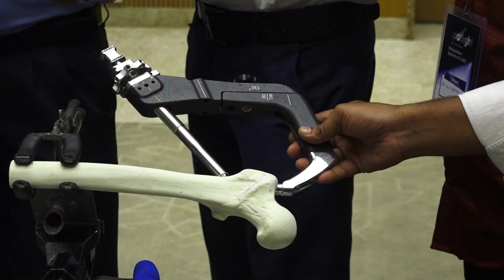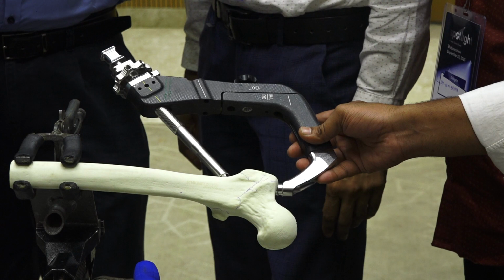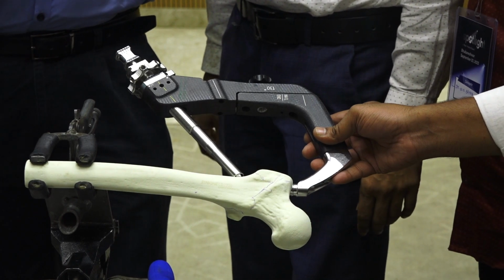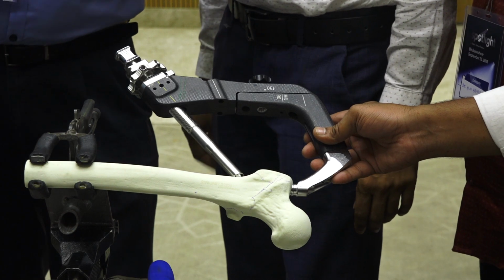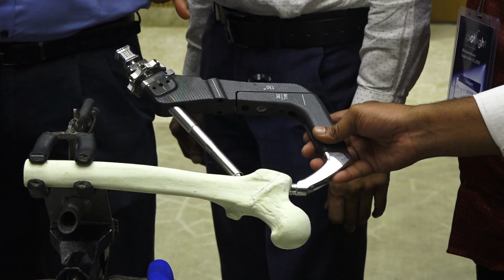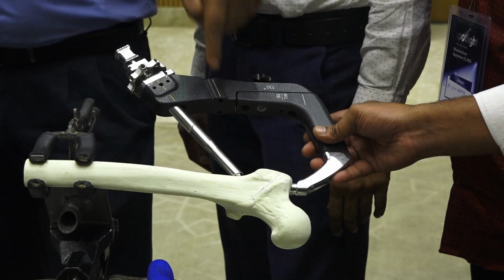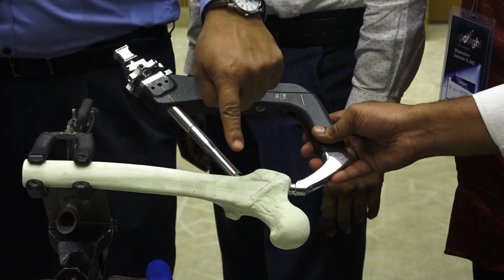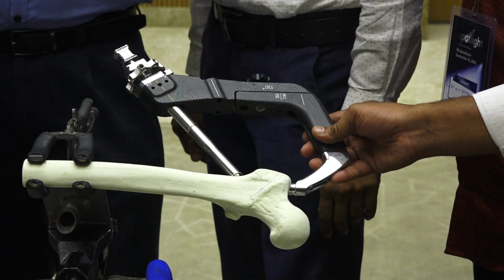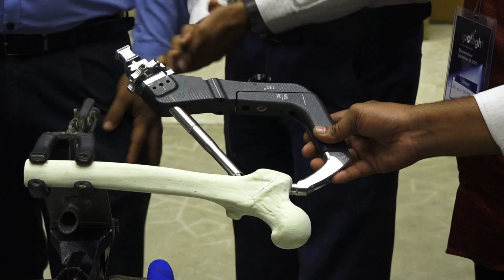So in that case, what usually can be done is provisionally fix it with multiple K-wires in different directions and put encirclage wires to put it as one unit. Then you do the drilling and put the guide wire. Once you put the guide pin there, after that you put the sliding screw, have whatever compression you achieve, then you supplement with some form of fixation to give the lateral.